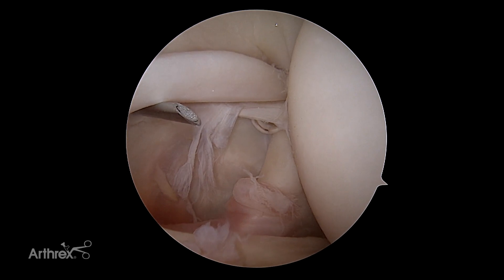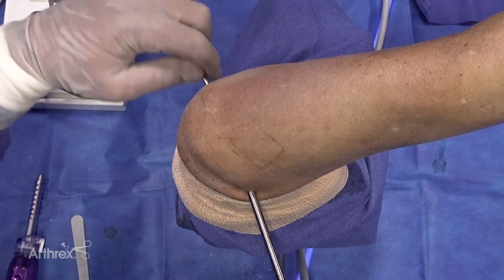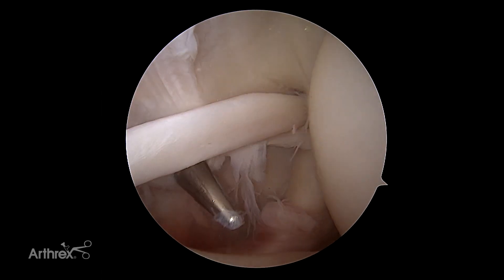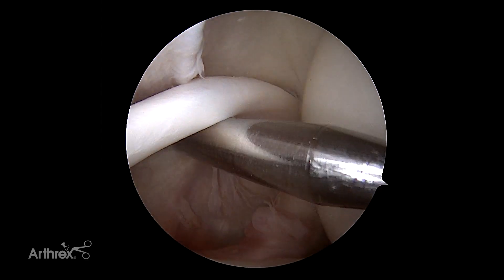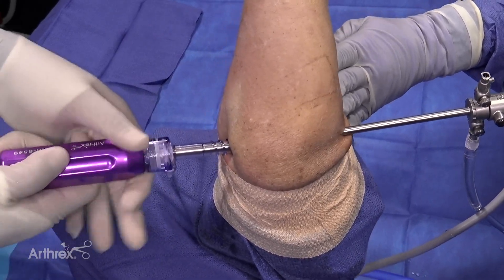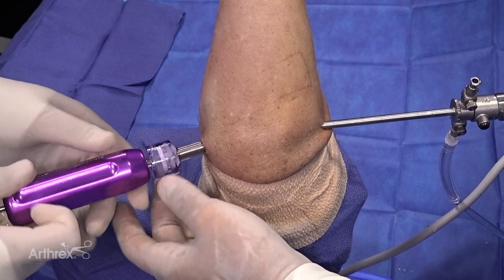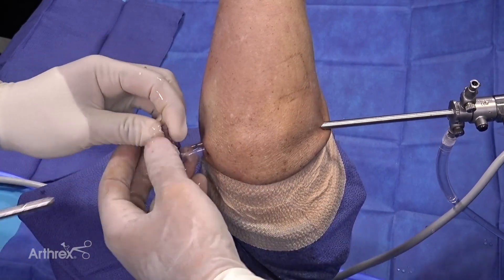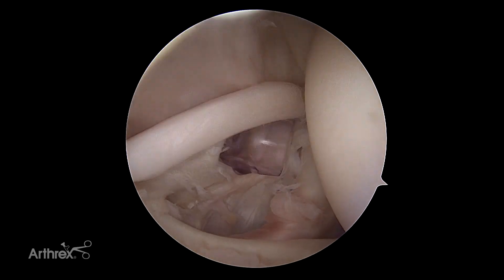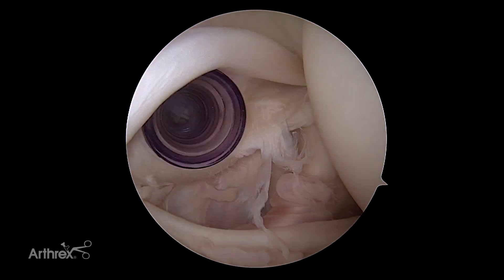Once we have verified where we want to make our portal, we're going to come in with a switching stick to make sure that we are piercing the shoulder at the spot where we want to be — checking to make sure that I can easily access above and below the biceps and reach the top portion of the intra-articular groove. We are then going to come in with a purple cannula. One of the key reasons I like this purple cannula is it allows for mobility. For most of my shoulders I will use a Gemini cannula; however, in this case the Gemini cannula can decrease your mobility to reach the top of the groove. This seven-by-seven purple cannula allows us easy access above and below and allows for increased mobility to provide access to the top of the subscapularis tendon at the most distally visualized portion of the intra-articular groove.